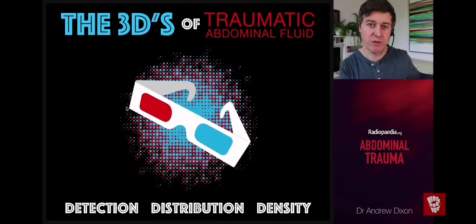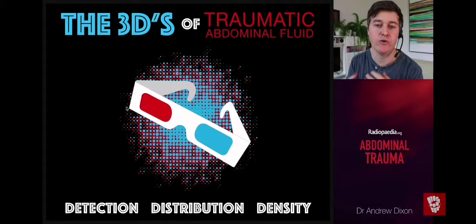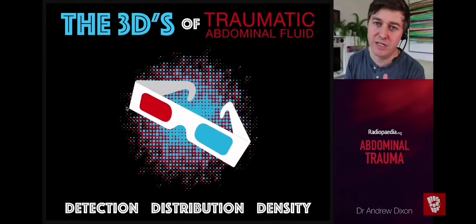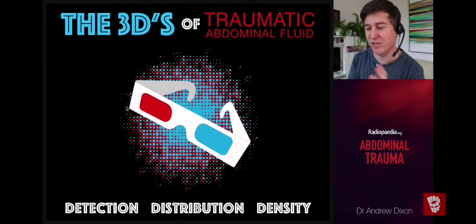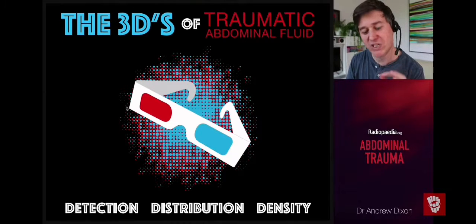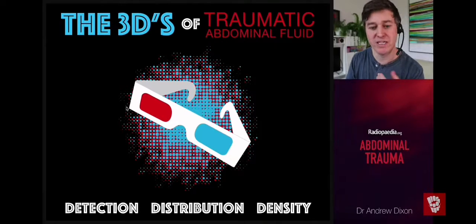Okay, so we've dealt with solid organ injury. Now the last portion of this talk is going to concentrate on traumatic abdominal fluid. And I like to teach the 3Ds. I used to call it Dixon's 3Ds because I came up with it, but I'm a very humble person, so I'm happy just to call it the 3Ds of traumatic abdominal fluid. So detection, distribution, and density. We've looked a little bit at detecting fluid, but we're going to go into more detail now.